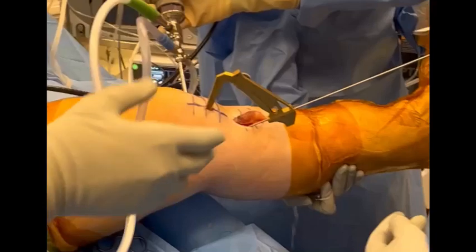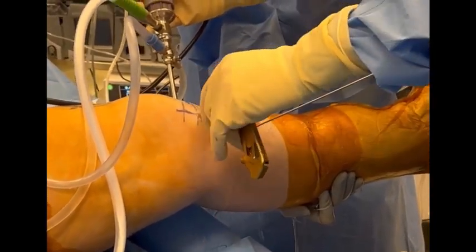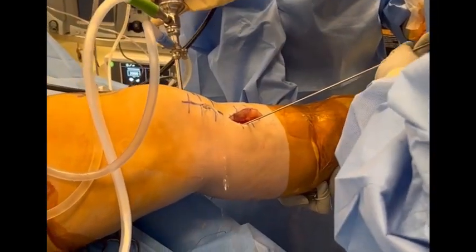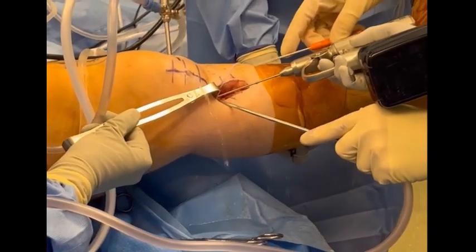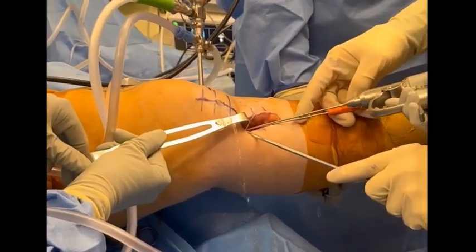The root insertion tunnels are then created using the ACL tibial guide with direct arthroscopic confirmation of tunnel placement. Once these tunnels are created, a suture passing device is utilized to pass the previously placed posterior root sutures into its corresponding posterior tunnel.